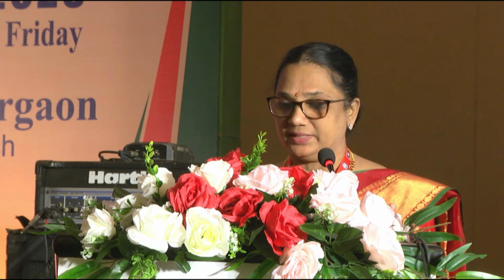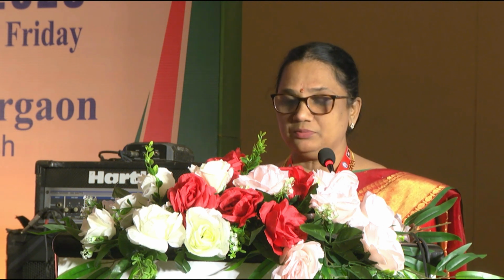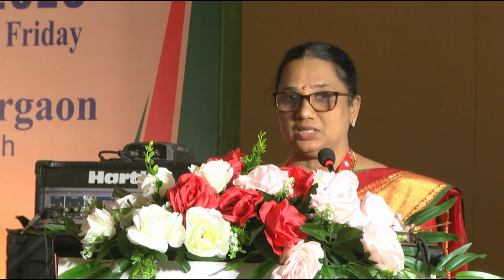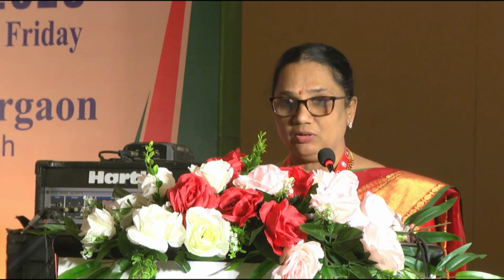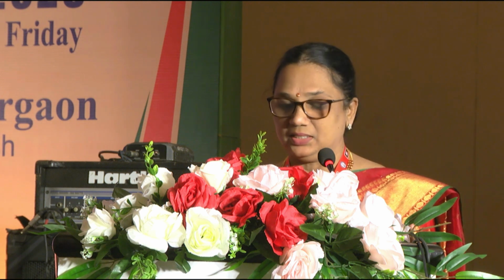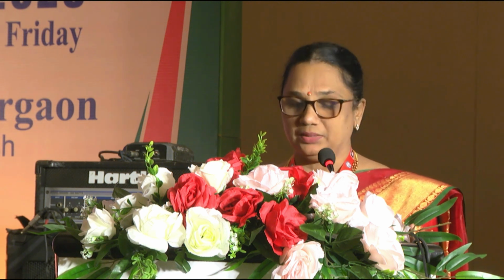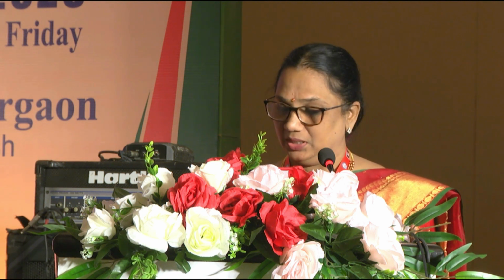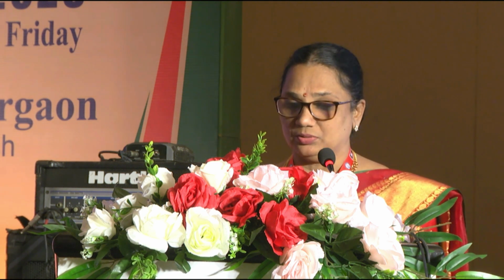and this forms a more challenging scenario. Here is an algorithm which says if it is above the left coronary sinus, you can use a JL. If it is on the same level as the left coronary, you use an EBU or XB. And if it is below, an AL1 or 2 is preferable. So having some algorithms is quite helpful.